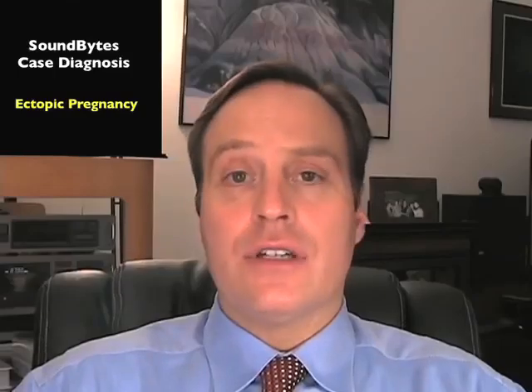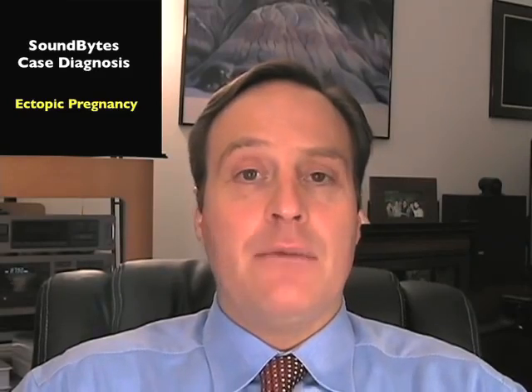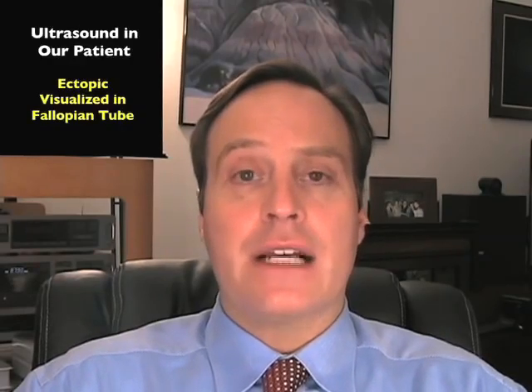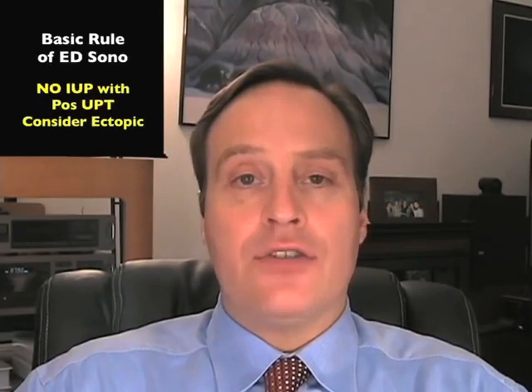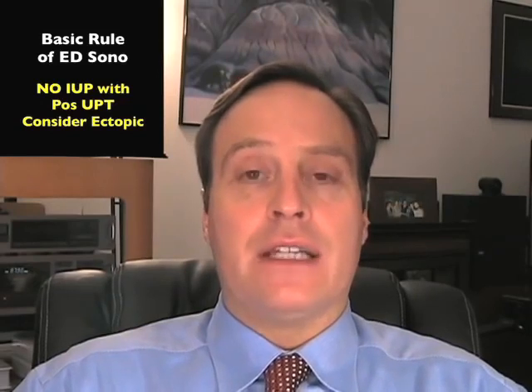So in conclusion, the final diagnosis in this case was ectopic pregnancy. And what was interesting about the case was that we were actually able to visualize the ectopic on closer inspection of the adnexa. I think that's an advanced maneuver, and one that you can employ when you become more and more adept at transvaginal ultrasound. But let's remember the basics: if you don't see the intrauterine pregnancy within the uterus and the beta-HCG is relatively elevated, you must get OB-GYN involved in the case.